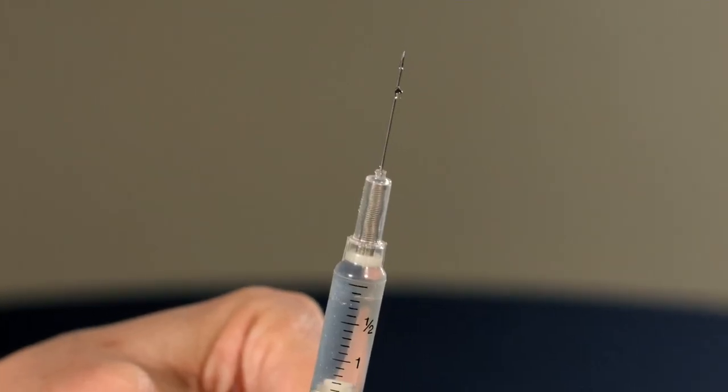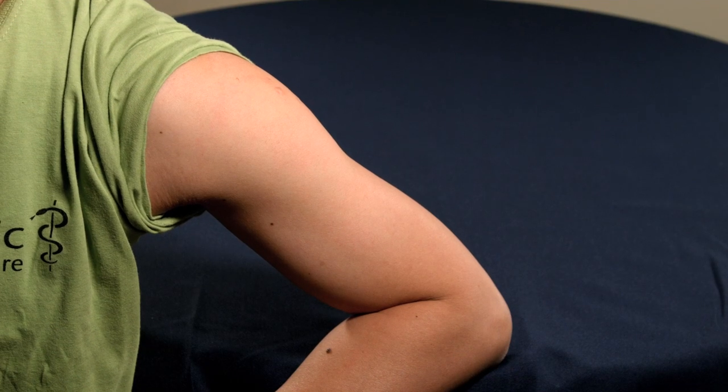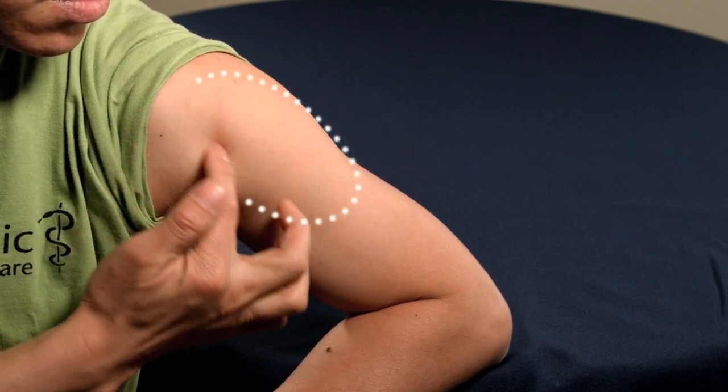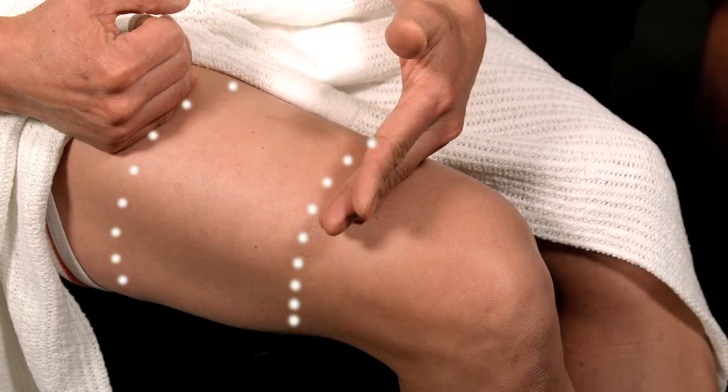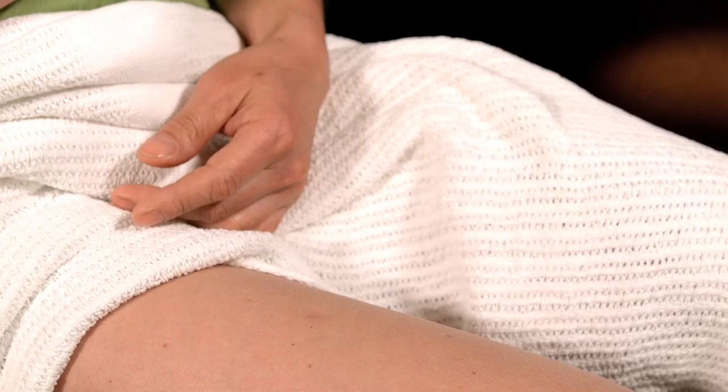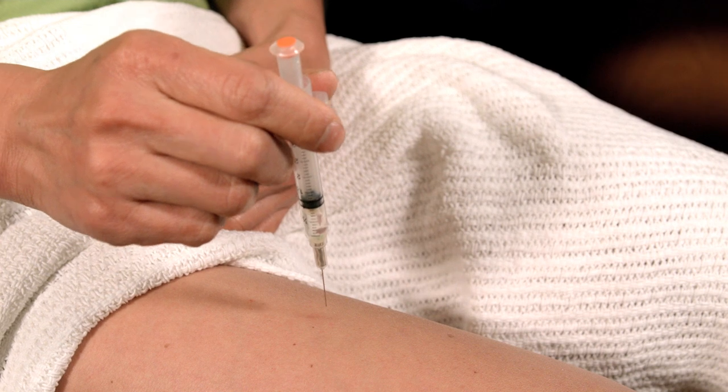The safety syringe needle can be injected into the deepest area of muscle on either your upper arm or the middle third of your thigh. Hold the needle like a dart over the injection site and plunge it into the muscle.